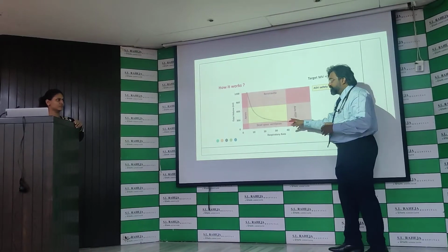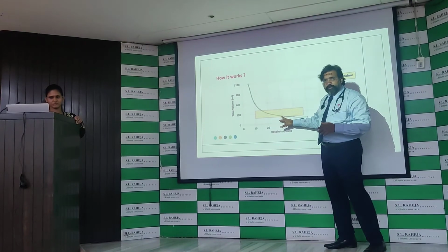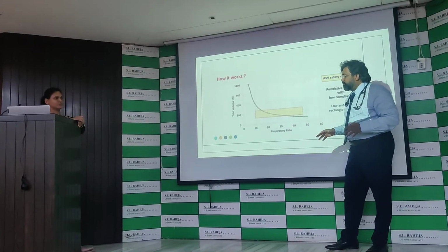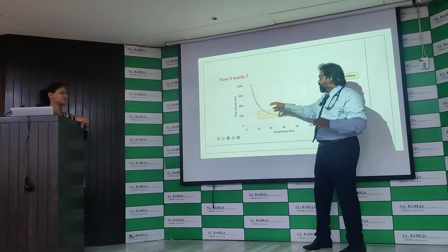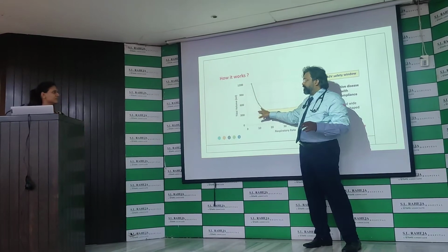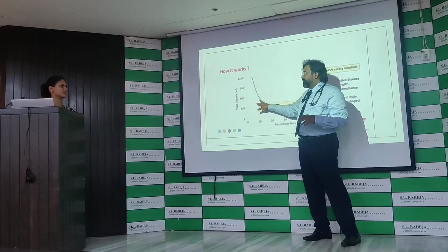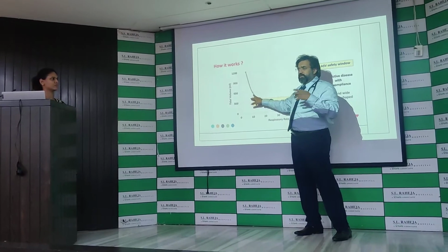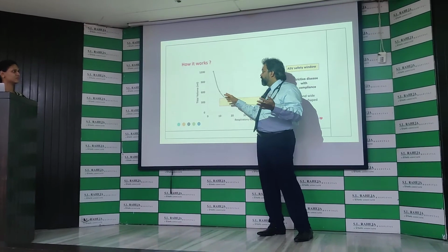For example, you have an ARDS. Okay, you have an ARDS. So let's go to the ARDS window. So this is ARDS. If you are managing this patient without this machine, say for example, what do you have to do? You can manage. No, we are managing. How do you manage? We have kept a tidal volume of 350, say 300 or 350. Okay, 350. But if it is not matching, we changed 350 to 345 or 400. Now over a period of time, what has happened is this patient is constantly breathing, and they start taking tidal volumes that are much higher.